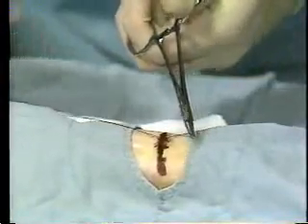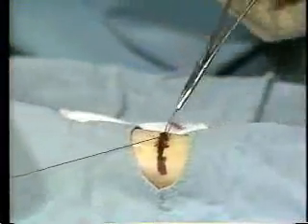Wrap the long end of the suture once around the needle holder in a clockwise direction. Pull the short end through the loop and pull ends to complete the last knot.